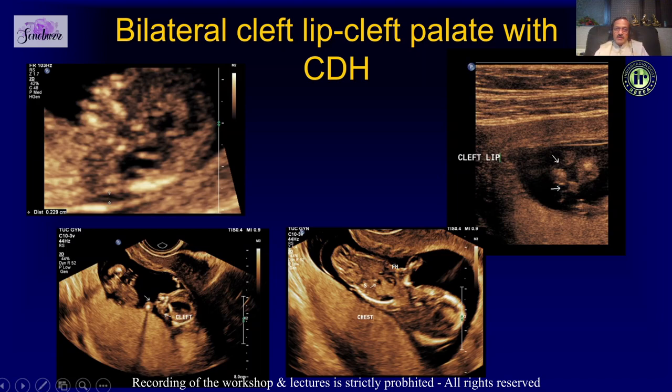Here is one example where you can see a gap in the maxillary line — not only a cleft palate but also a cleft lip. This fetus also had a diaphragmatic hernia. Most of the scan was done either with a transvaginal probe or a high-frequency probe.